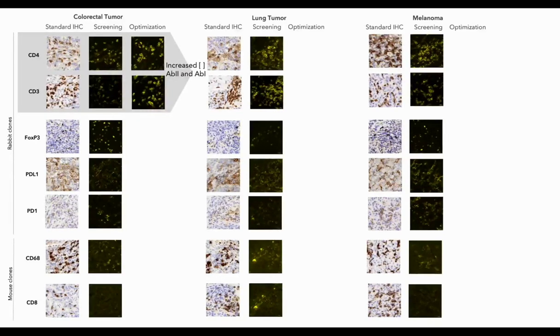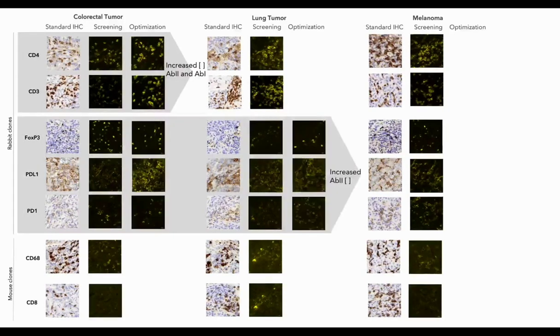We would typically look at readjusting the concentration of primary antibodies first and/or the incubation time. As a second step, we could also play with the concentration of the secondary antibody and decide or not to include an additional blocking step.